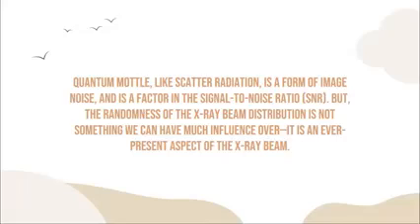Okay? And then so naay buhaton ninyo para ma-decrease ang quantum mottle for digital imaging systems. Of course, we cannot increase mAs because increasing so will increase patient dose. Diba ang gina-ingon sa slides, gina-ingon sa akong reference na dapat dili daw mAs ang increase since again, it increases patient dose. So ang atong gina-increase ana is kVp, although there is an increase in scatter radiation, but it's still manageable man siya, makakaya man siya sa mga algorithms sa inyong computers. Paggawas niya, matanggal itong mga scatter radiation sa images.